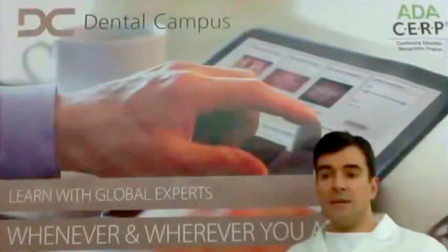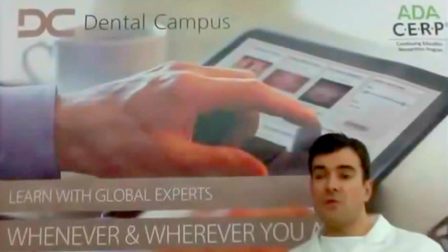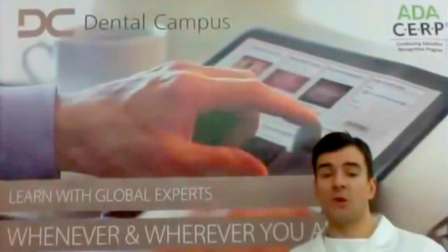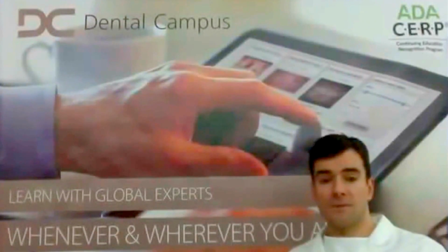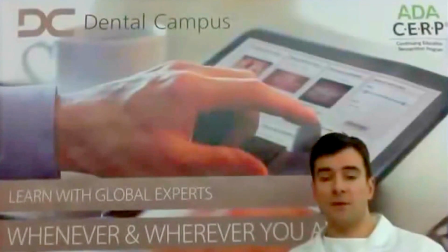So the ideally provisional. So the question is now, of course, do we choose an immediate restoration? Of course, if we go for immediate restoration, in that case, we're going to use a resin crown, which can be bonded either on a metal or on a resin abutment.